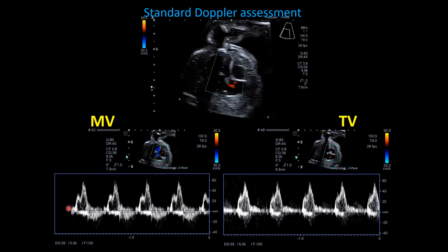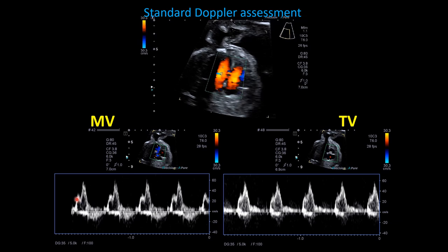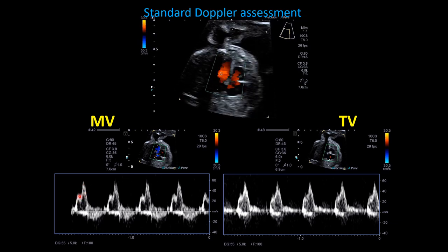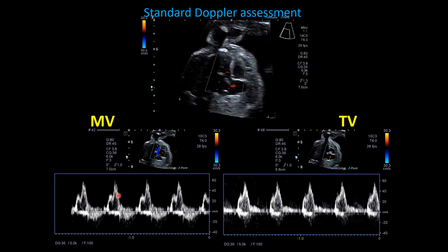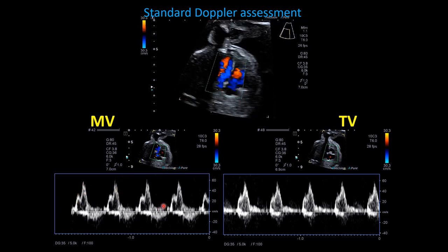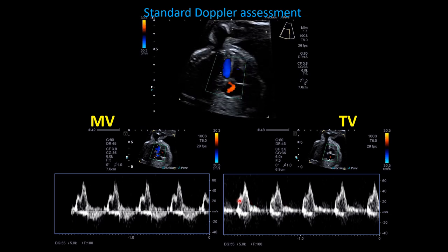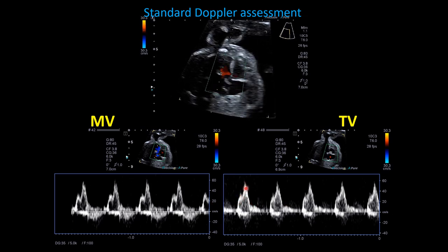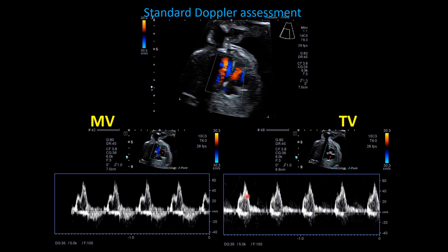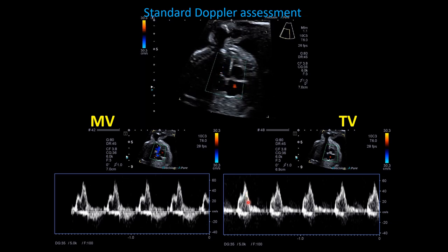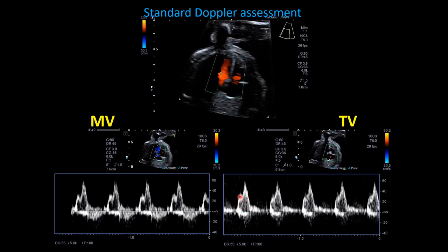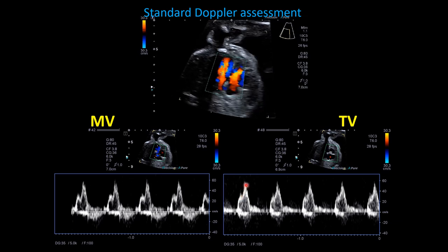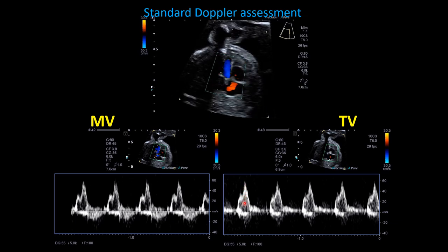These are normal tracings. You have a smaller E wave and a larger A wave; the E wave is roughly half the size of the A wave in both tracings. With a normal fetal heart rate, you should have biphasic — two waves, an E and an A — and they should not be fused together.